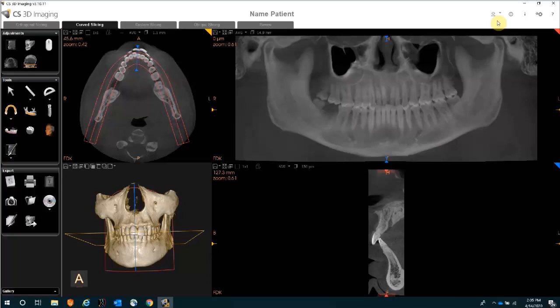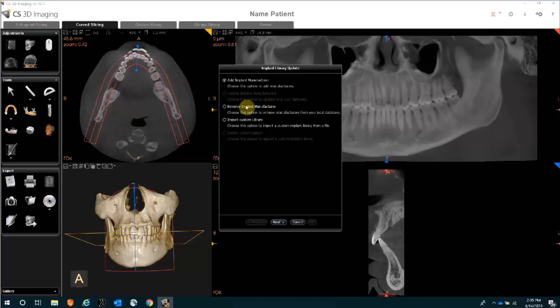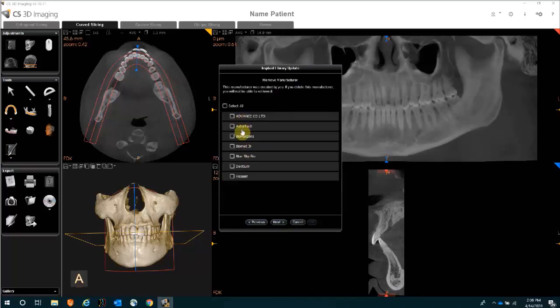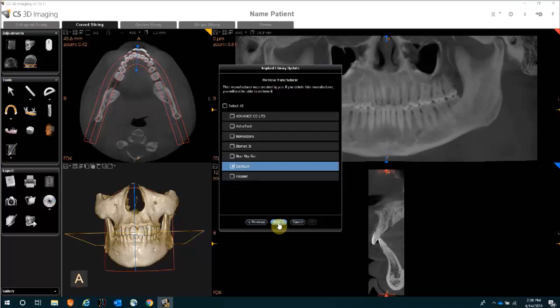If you are looking to remove an implant manufacturer from your list, go back to the same icon — your implant library management tool — and click on it. Select the option to remove, then click Next. Pick from your existing imported library, select which one you would like to discard, click Next, and you will no longer see that implant library.